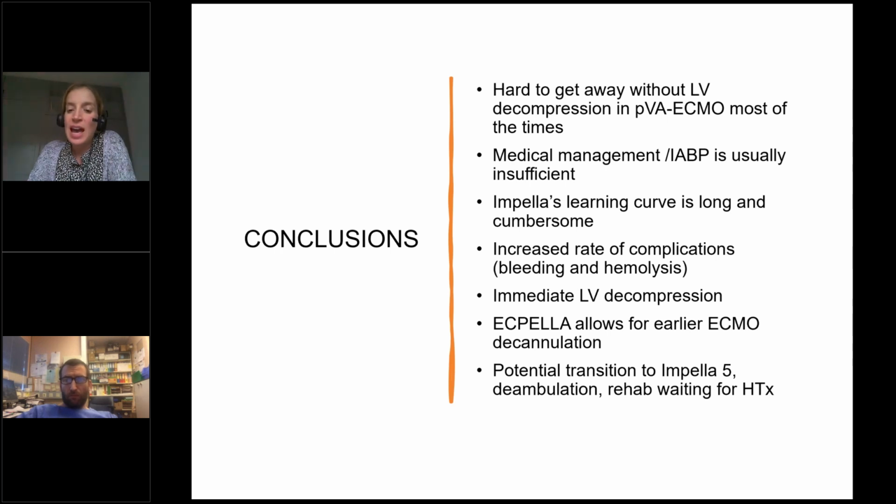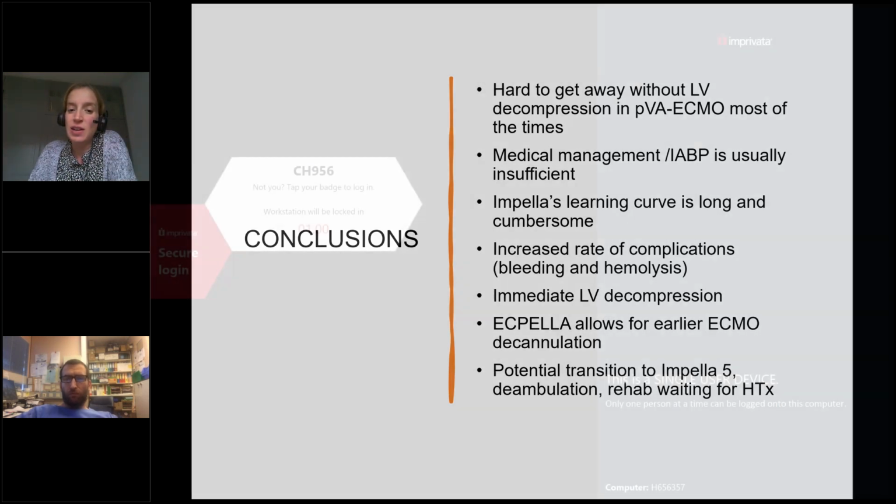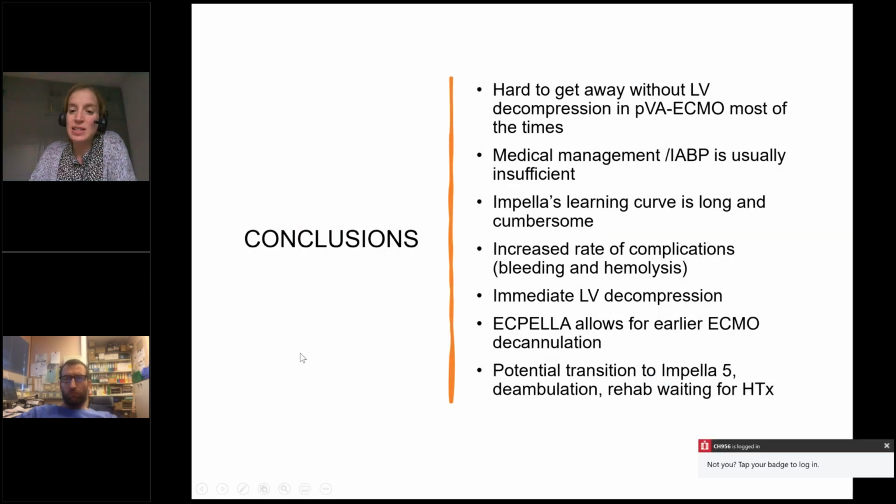For Impella, I would say most of the time it will be an unplanned procedure, so it will be an Impella CP through the groin. Impella CP can give you up to 3.8 liters per minute of flow, but you don't usually need that. So we will start at P2, P3, and we will echo the patient and make sure that the ventricle looks happier, less distended, and that the end diastolic volumes are coming down, the MR is getting better, and there's less smoke in the ventricle. And maybe a flow of 2.5, 3 liters will be enough to decompress the ventricle.